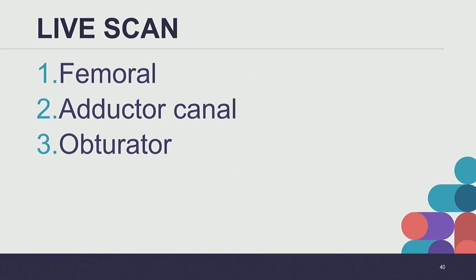right underneath sartorius, staying away from any hyperechoic structures that might resemble the nerve to vastus, or you can come out very lateral, pop under sartorius way on the lateral side, and as you're advancing, hydrodissect and create a pocket of local as you advance over the nerve to vastus and the sartorius.